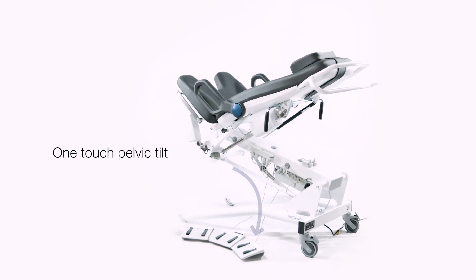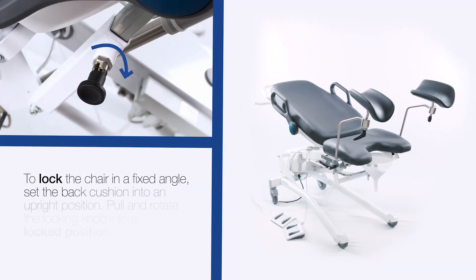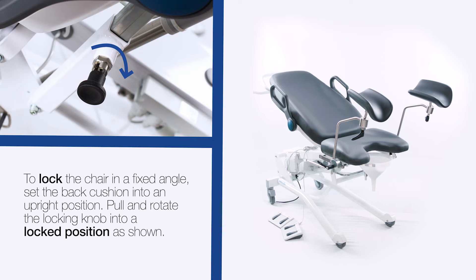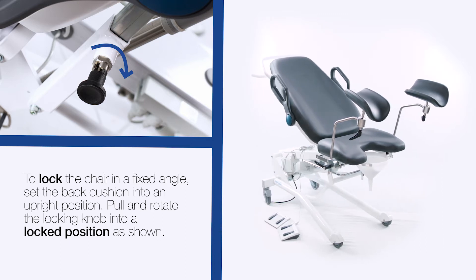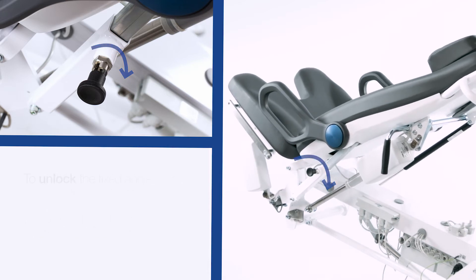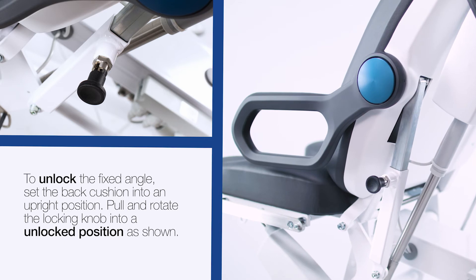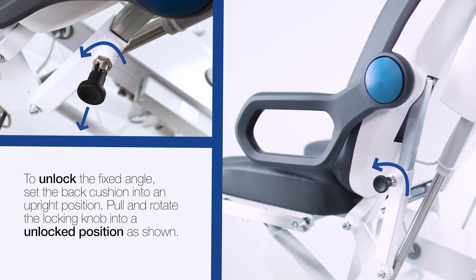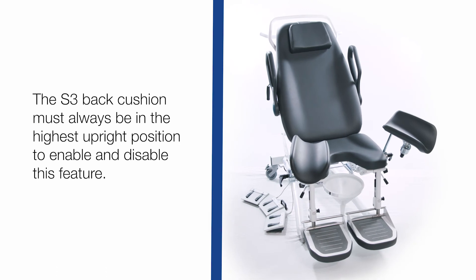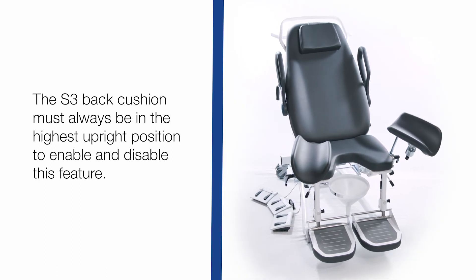Using one pedal on the foot control moves the seat and the back to the desired position. To lock the chair in a fixed position, set the back cushion into a fully upright position, then pull and rotate the locking knob counterclockwise. The S3 back cushion must always be in the highest upright position to enable and disable this feature.